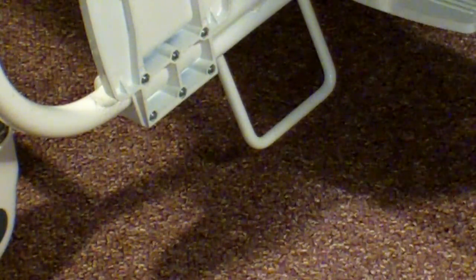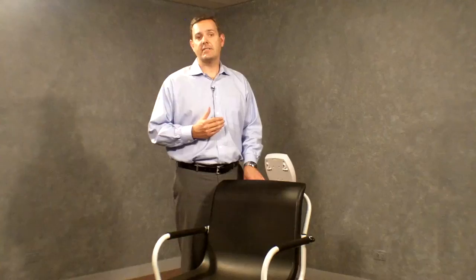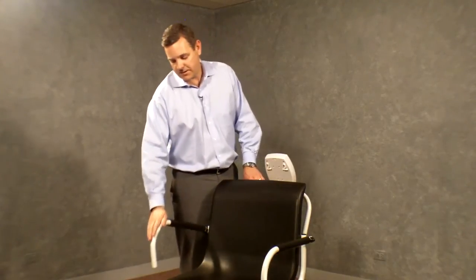Then lower the foot rest and have the patient put both feet on the foot rests. For side access, leave the foot rest down and lift an arm to allow the patient to slide in from the side. Once on the chair, lower the arm for safety.